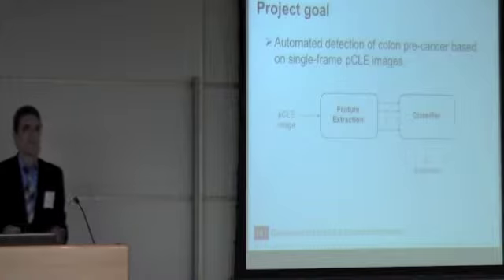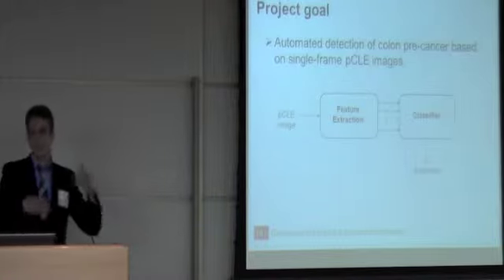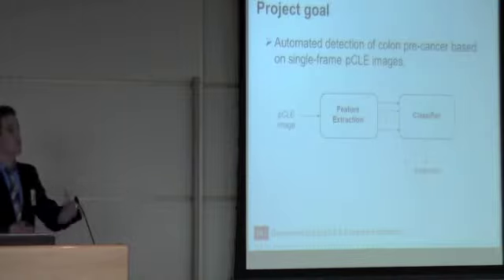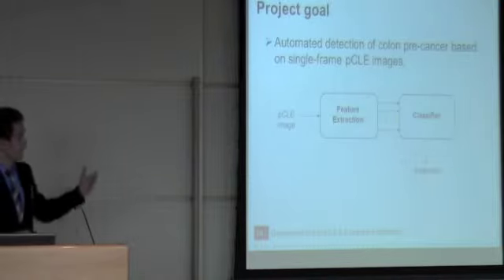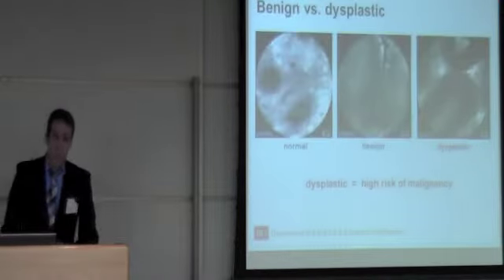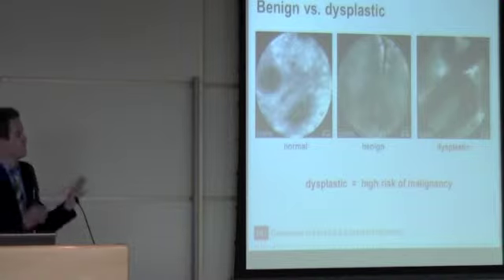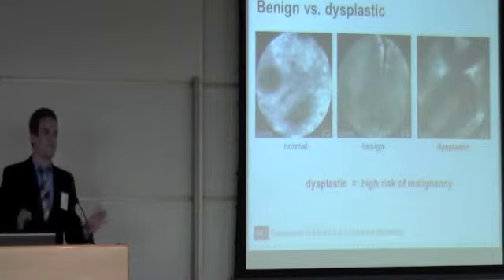So this translates into a typical classification problem. PCLE image on the input, we perform some feature extraction, input those features into a computer classifier, and receive a diagnosis on the output. Now, before I go into discussing feature extraction, I would like to give you a perspective on what kind of data we are working with.